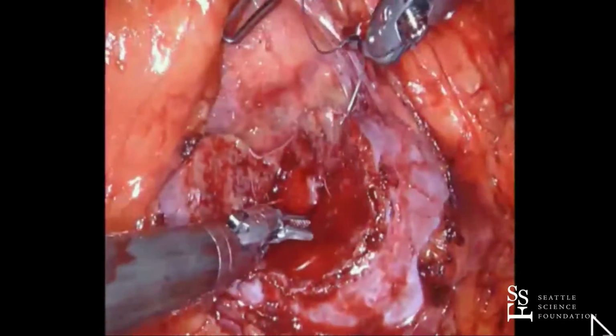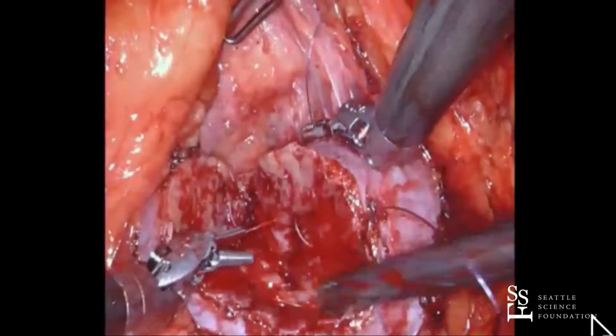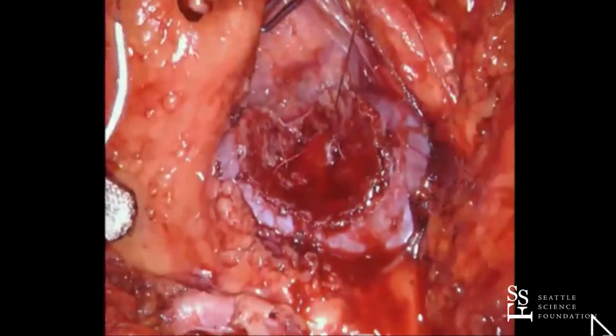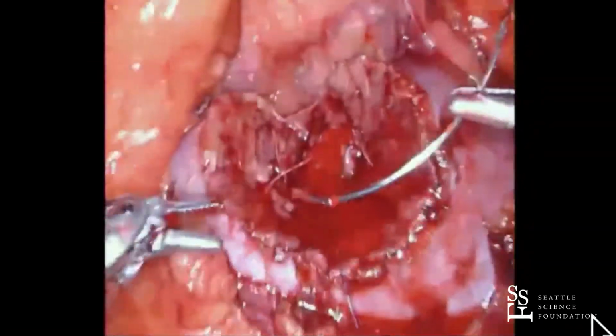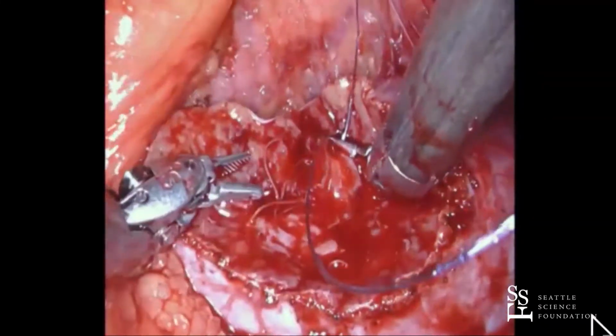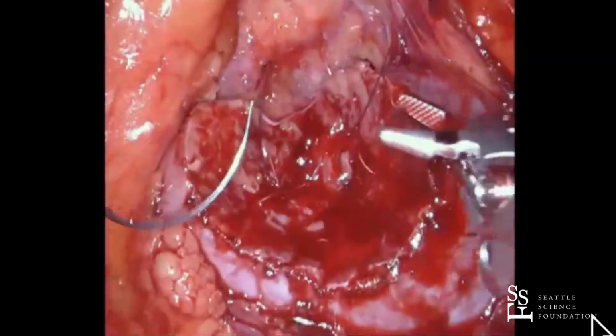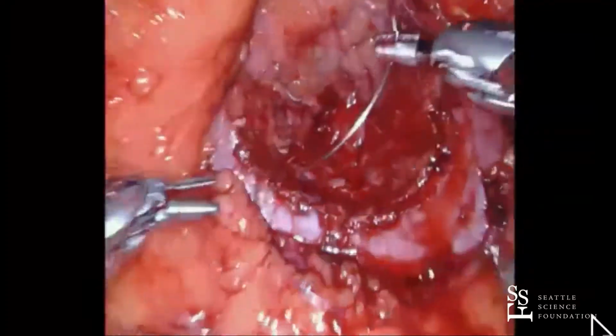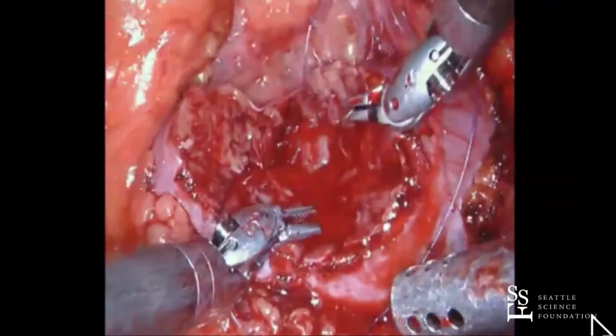So we're off ischemia time, and you can kind of see there's a natural way this wants to close. It wants to close cephalad to caudal. So I'm going to close the dead space here a little bit with this layer. This looks like an SH needle. It is, Caden.